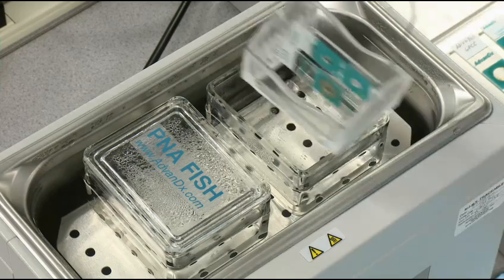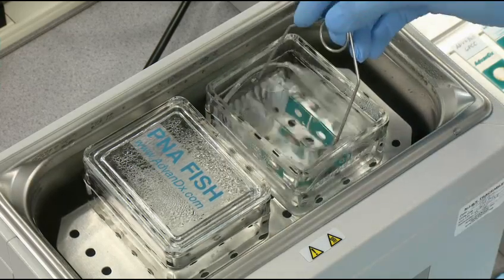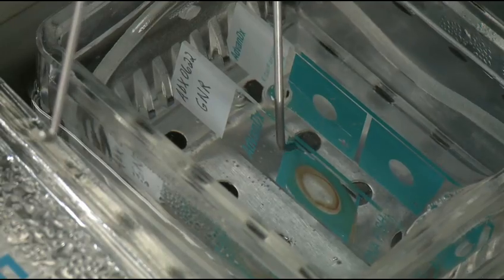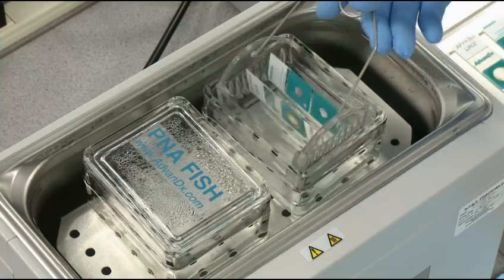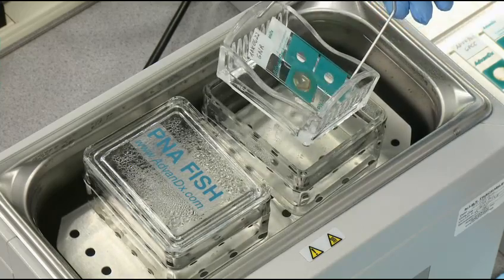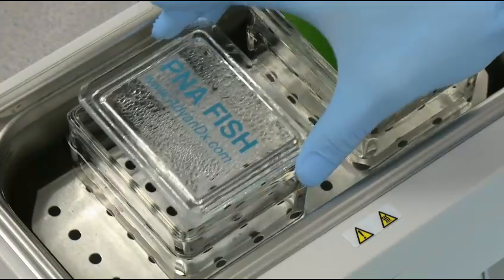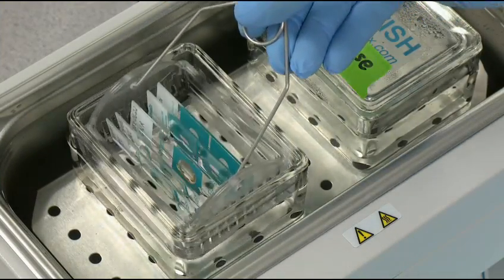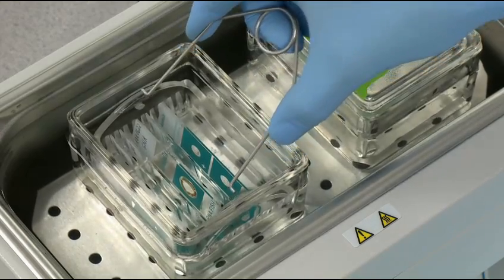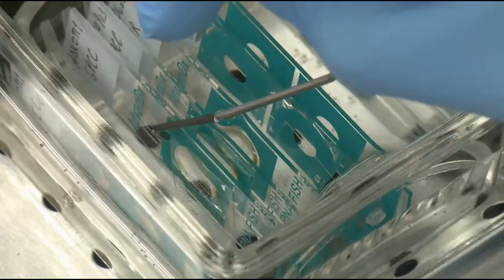If testing gram-negative samples, immerse slides in the 55 degree water rinse and carefully remove cover slips. Remove slides from the water rinse, and then place gram-positive and yeast slides in the slide rack. Immerse slides in wash solution and gently remove any remaining cover slips.